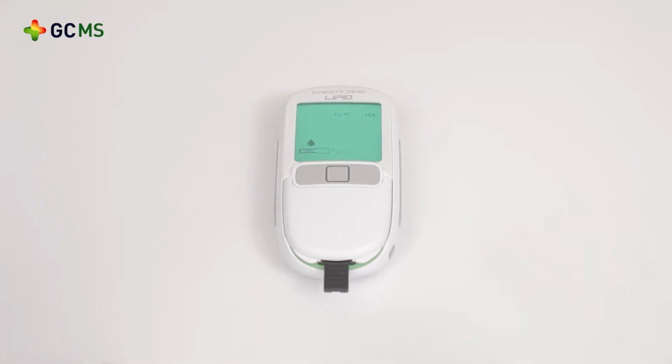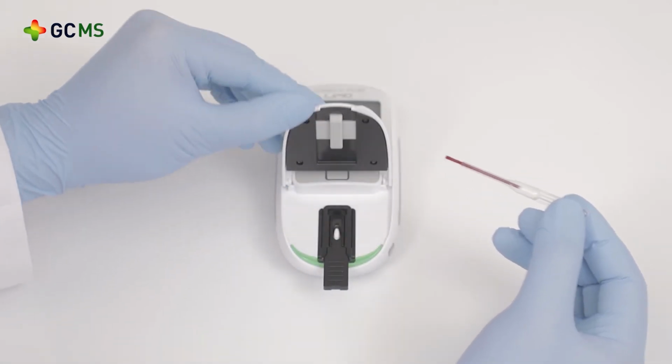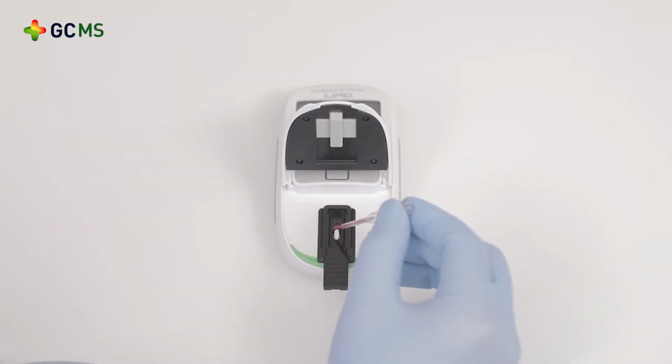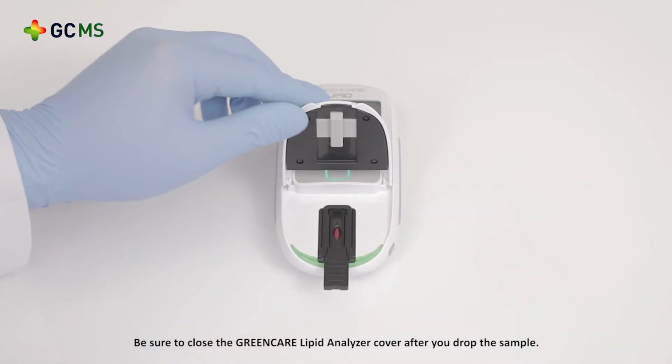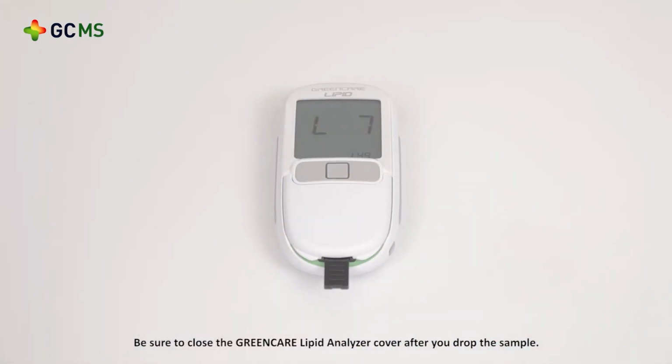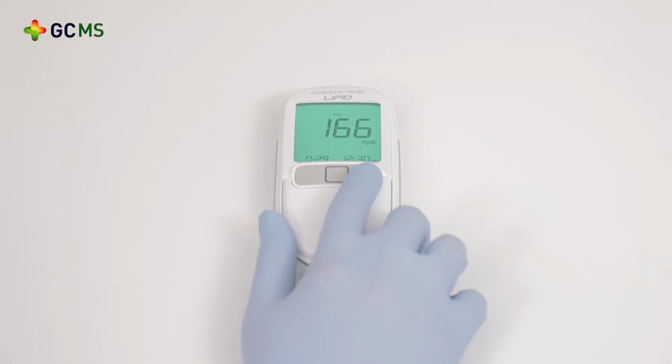When you have completely taken the capillary sample, gently press the tube to put the sample into the strip hole while closing the air hole on the capillary tube with your finger. Be sure to close the analyzer cover after you drop the sample. When the analyzer cover is closed, the analyzer automatically runs a lipid profile test. In less than 3 minutes, the result is displayed on the screen and is printed out on the thermal printer.